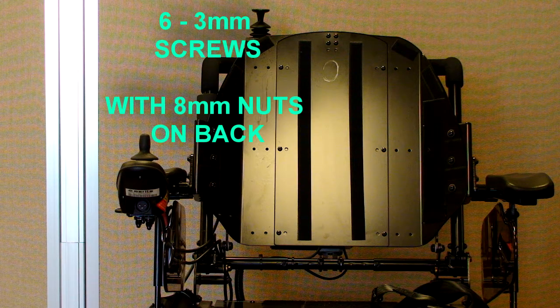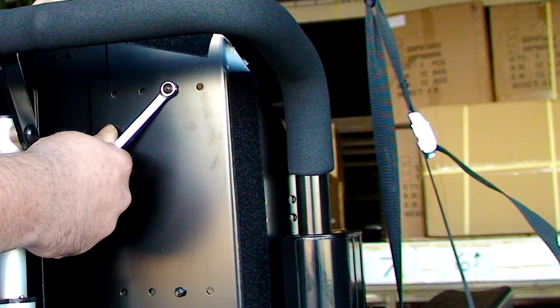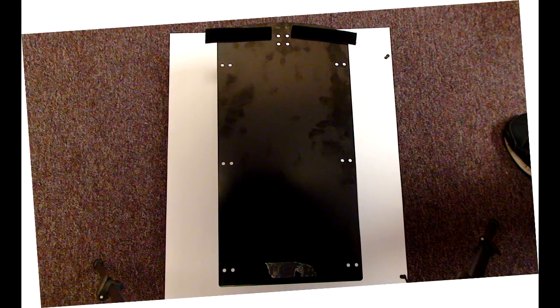Next we are going to remove the center back plate. There are six 3-millimeter allen screws with 8-millimeter nuts on the back that hold the back plate in place. These bolts need to be completely removed. You can then remove the center back plate, which at this point is probably still held on by the velcro strips. Just peel back the velcro strips from the side panels enough to remove the back center panel. Leave the velcro strips hanging from the back panel as they will be used again once the back panel is reinstalled.